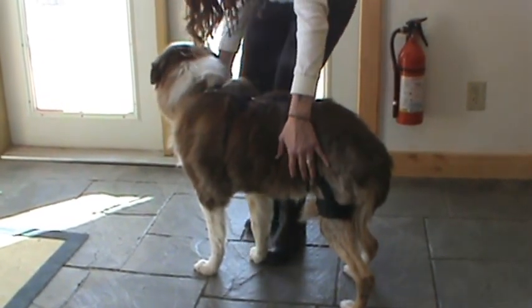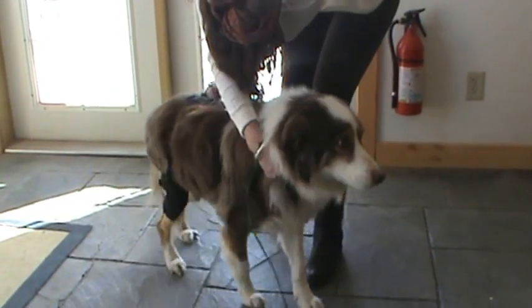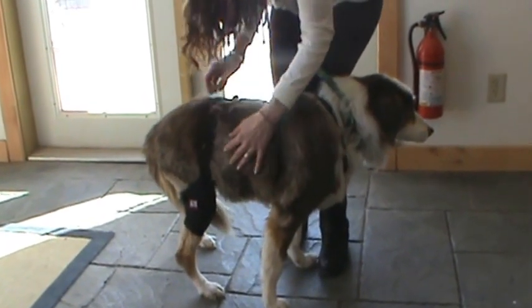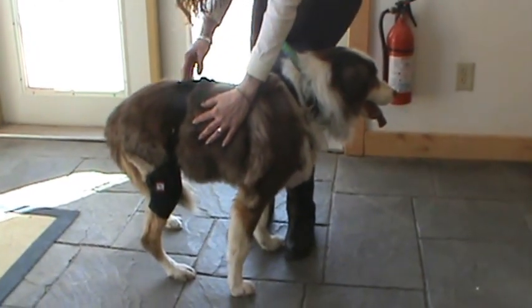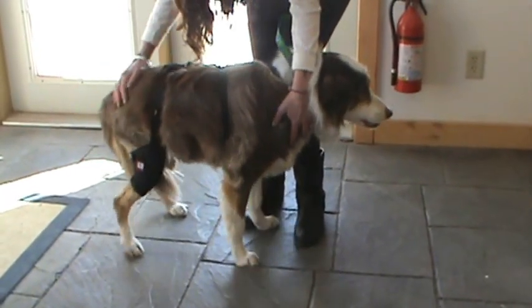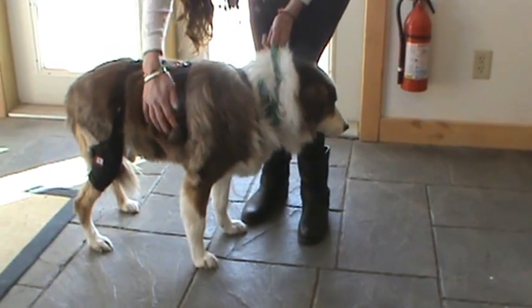It's not around anywhere near the hip. We'll turn Angel around again so you can see how it is here in the front as well. The webbing strips go to the front rather than straight up and down. That's how you put on the muttony brace. If you have any questions, please give us a call at 970-881-2636. Thank you.